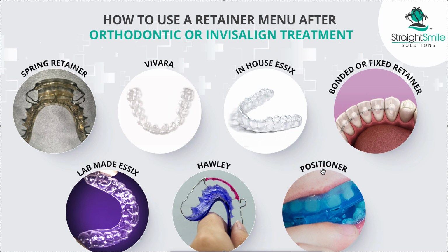They also have semi-custom ones. So there's a kids version of this too, but there's no custom for kids. Healthy Start by Ortho makes a kids version. It's called the G. The adult version, they do have an adult version that's semi-custom called the N. So you can buy those too. You have to be a Healthy Start provider to buy those though. TP, you do not have to be a provider to buy one of those. There's no expensive course you have to take.